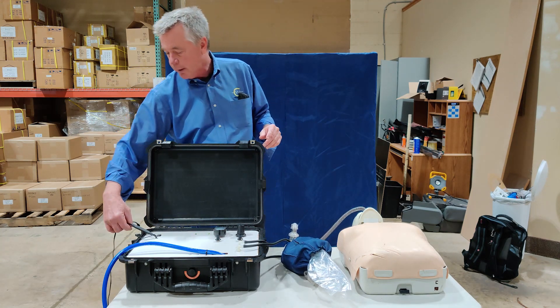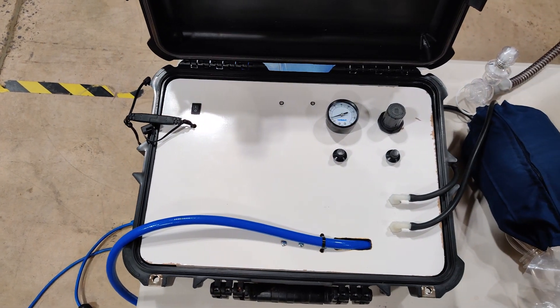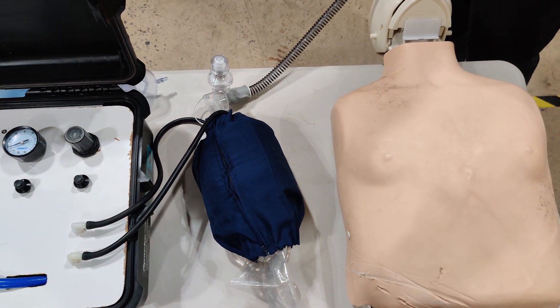When you have power, you hook it up and the battery charger will charge the battery while the unit is running. We're doing a tidal volume of approximately half a liter. The bag can be fed with oxygen so that mix can be at whatever ratio the doctor feels is necessary.